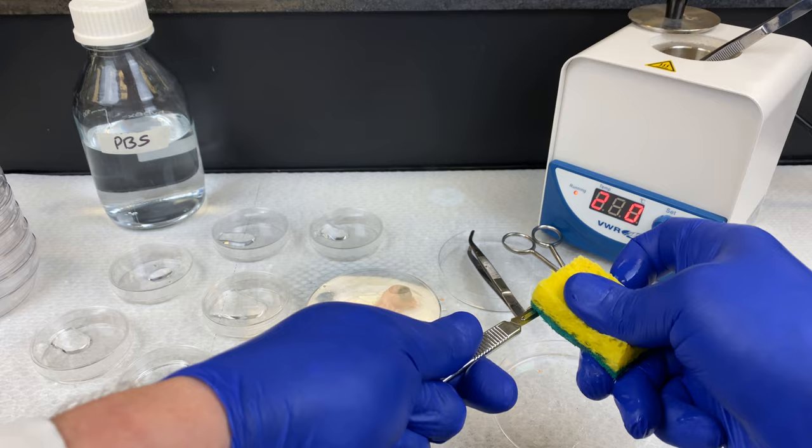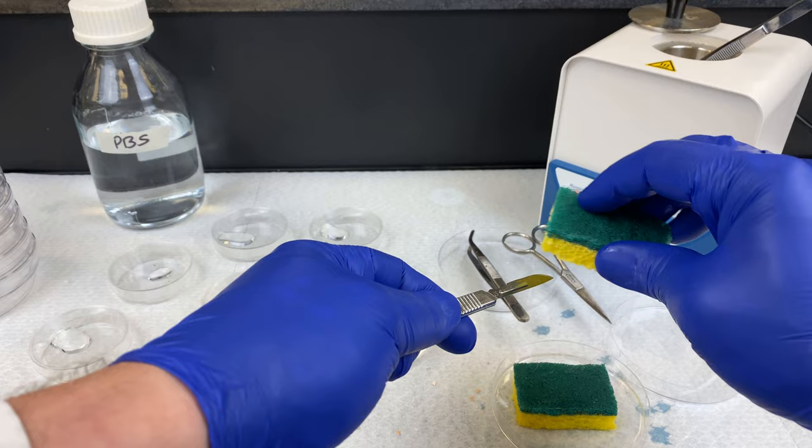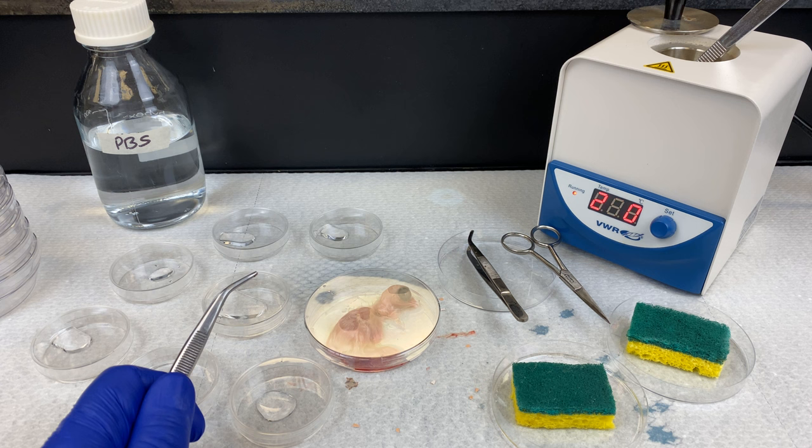The scalpel blade is razor sharp, so make sure when you're wiping it, not to cut yourself. When you place items into the sterilizer, leave them in for only 10 seconds. If you leave it in longer, the heat can conduct up the metal and when you pick it up, it can burn you. As you can see, I've left my forceps in there a bit long — try not to do that.